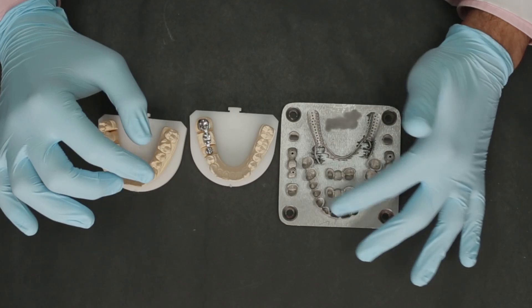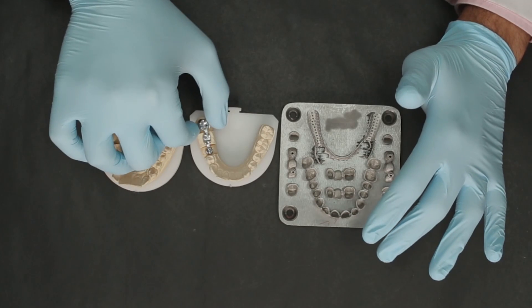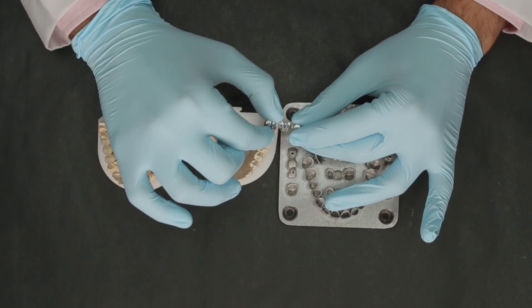It looks absolutely beautiful. This is how the chrome cobalt frameworks are then retrieved from the DMLS unit. The chrome cobalt framework is then finished and polished, and this is what you get.